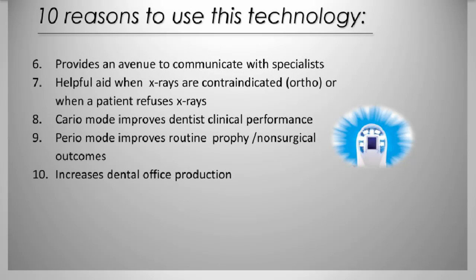A lot of times, I've seen this, and it's a little embarrassing for the specialist, but if the general dentist has this technology and the periodontist, let's say, doesn't, they can't put anything on perio mode or caries mode and things like that. So it is important to be able to share with them the information that you have.